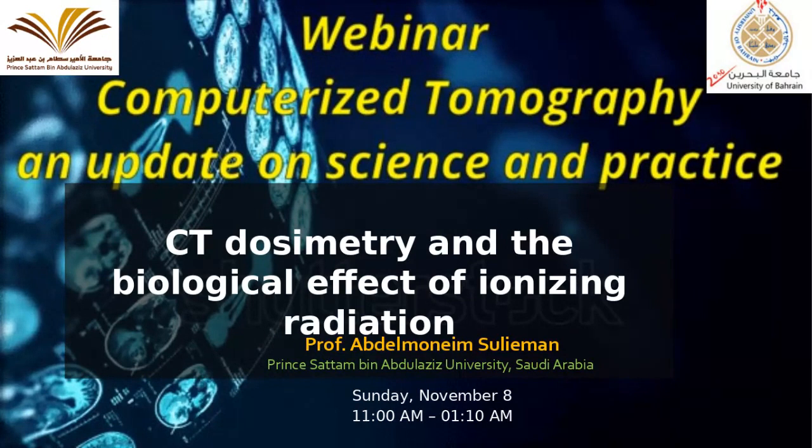This is the main issue, because we always have a formula: very good image quality, or very high image quality, means very high radiation dose. This is the current formula. Scientists and engineers try hard to provide very high image quality with less radiation dose, by developing very sensitive detectors and providing very good imaging techniques.